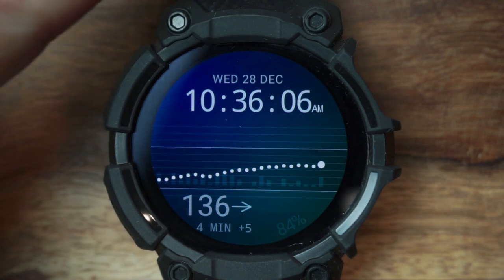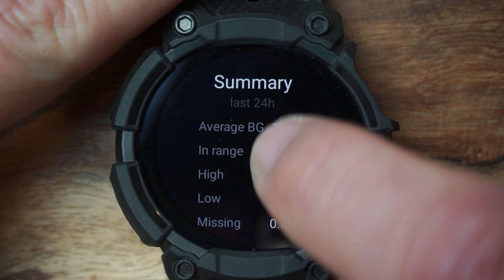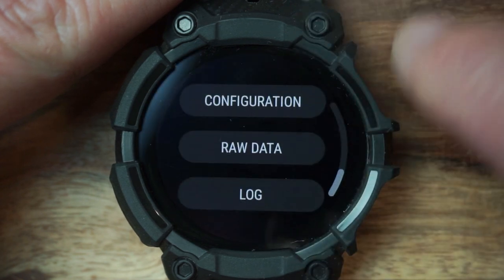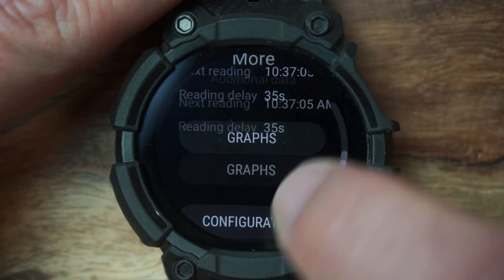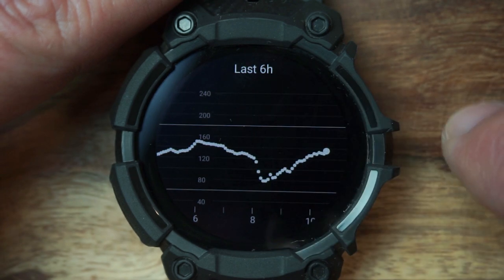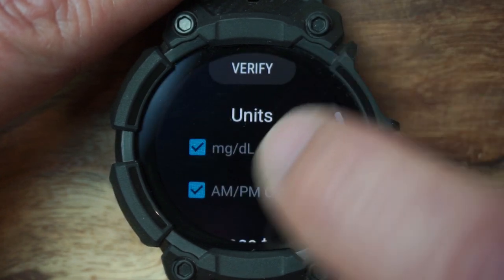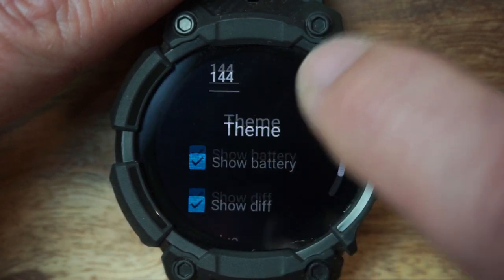There you have it — a good-looking app. Let's double-tap: it's showing a summary with status and graphs. There are configurations to change colors, a log, and raw data. The raw data is pretty cool. In the graphs view, scroll up and down to see the 6-hour, 12-hour, and 24-hour graphs. Going back, you can continue to configure settings from there as well.